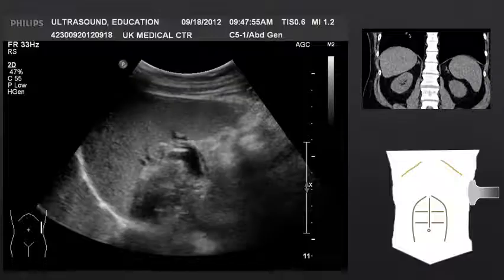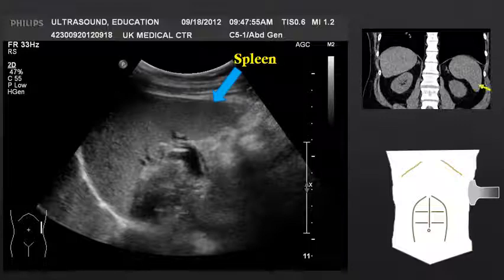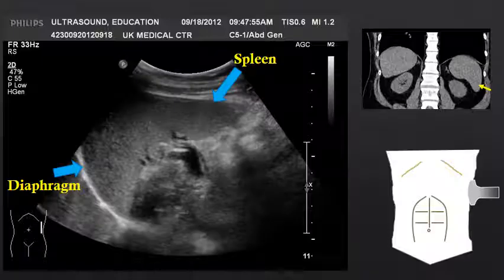This is a slightly different view of the spleen. Notice the spleen's characteristic shape, the diaphragm along the superior margin, and some splenic vessels arising from the splenic hilum.